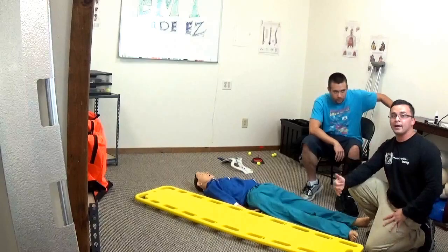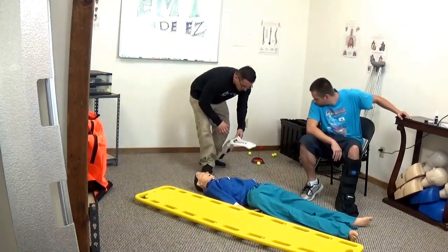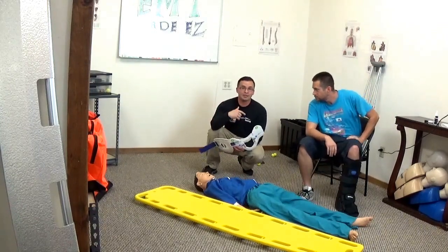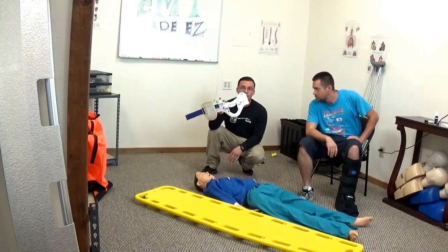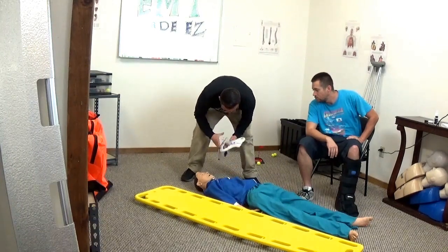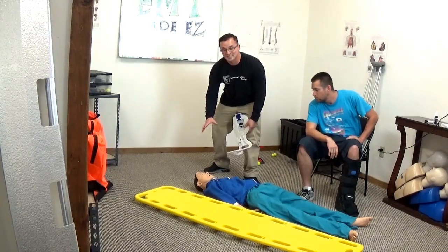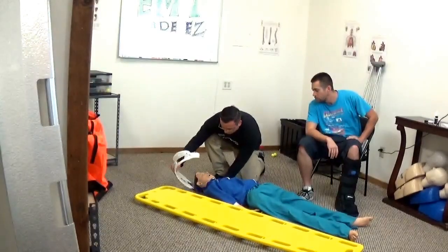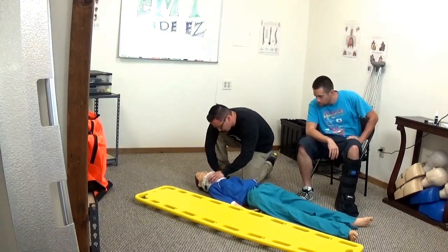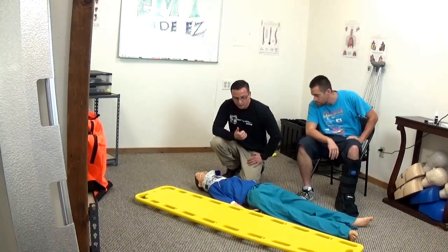After CMS, go ahead and measure for a cervical collar size. If you're not sure how to measure this against your patient, look at the CAD video where I go into detail on how to measure. I'm going to measure for about four inches. Mind you, your partner is still maintaining C-spine. Put the collar on your patient and ask: is that comfortable, is it in place? We'll say it is good.